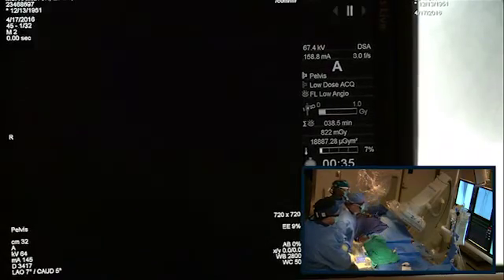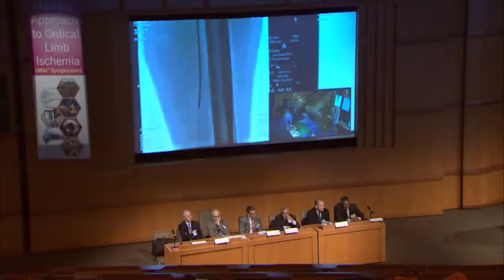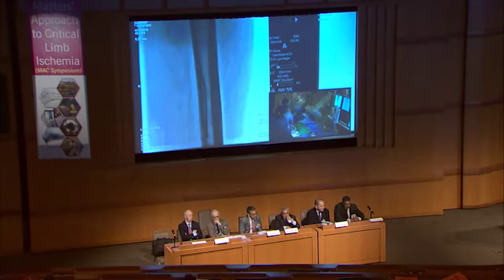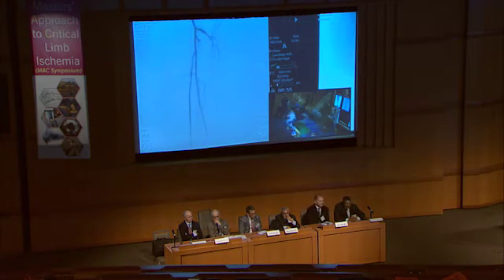I wonder if some of that is, I think dye stains in smaller vessels look slightly worse when the vessel actually recoils because the dye stain stays on the outside. So that's probably what is happening here. But I think the flow is very good. I personally, if I were the operator, would at this point leave it alone and take some more pictures. It's looking worse now, actually.